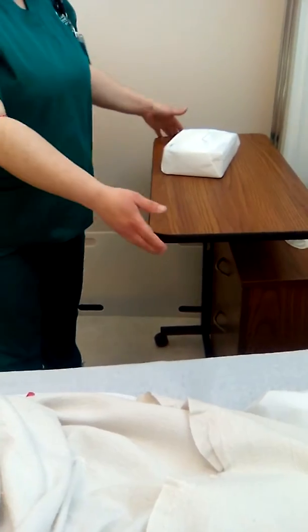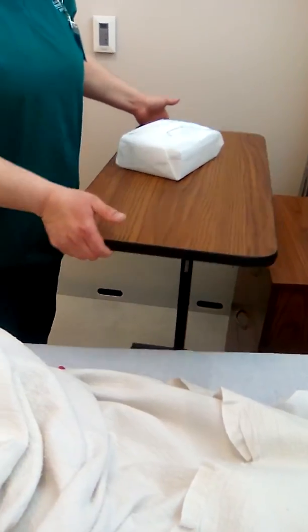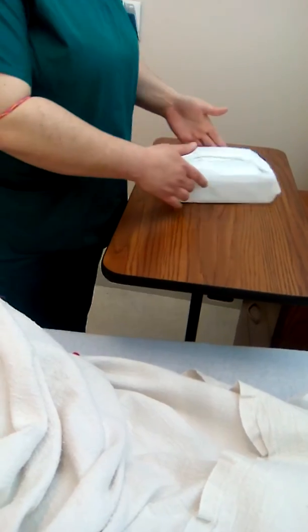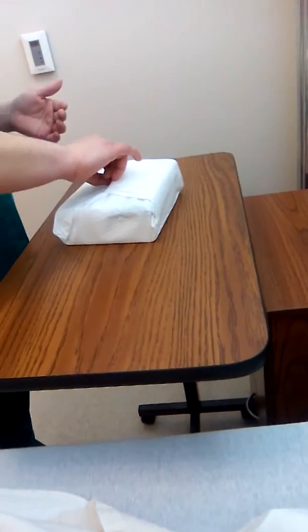I will then arrange my sterile field, make sure it's at waist level. I will open my kit.